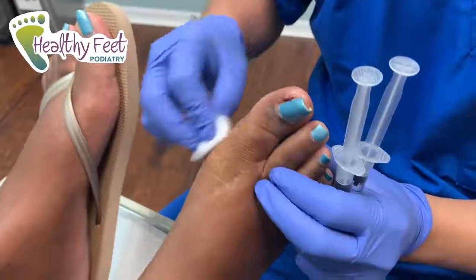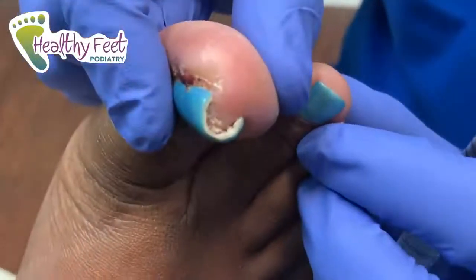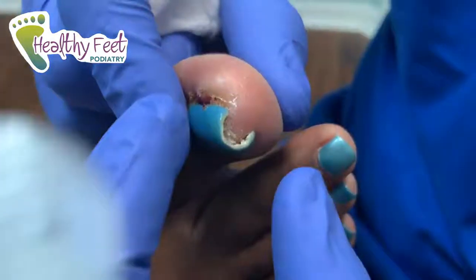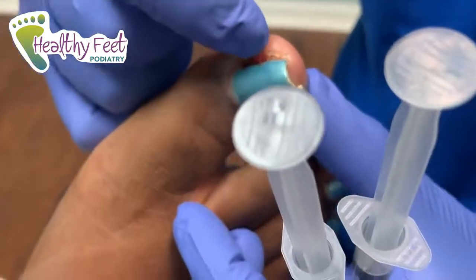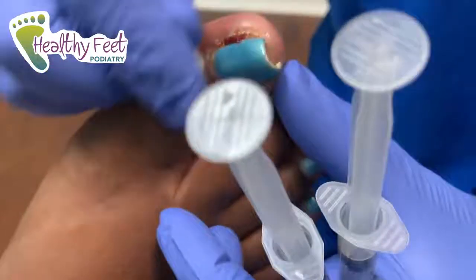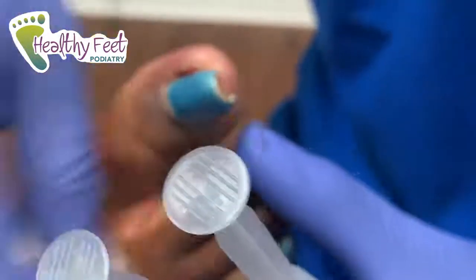All right, so we're looking at the toe here. See how the nail is directly pinching into the skin? It's really curved in. It's causing the skin to push up against the nail, and it hurts. That was her going, I'm so sorry. So what we got to do today is numb it up.